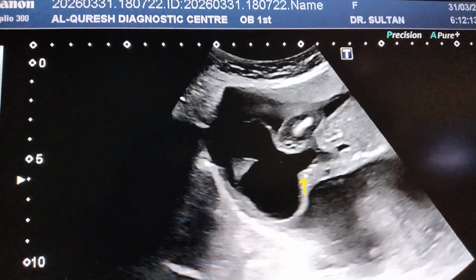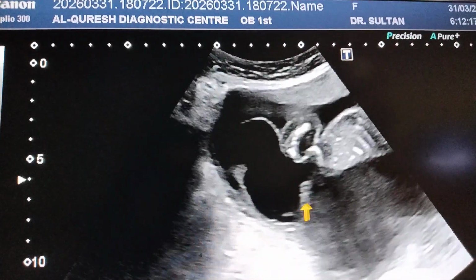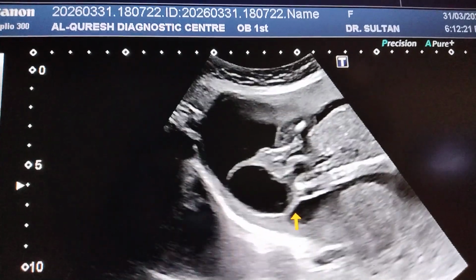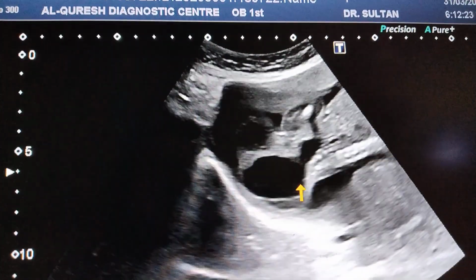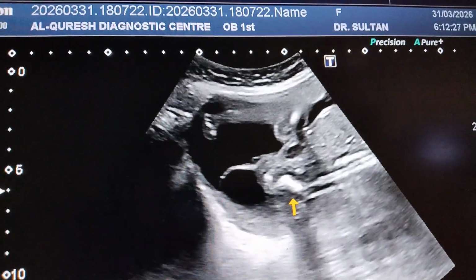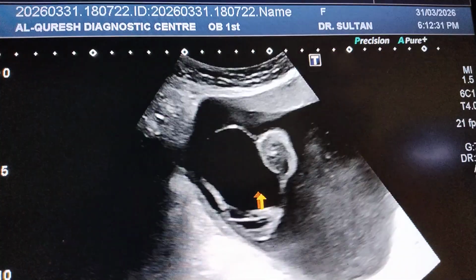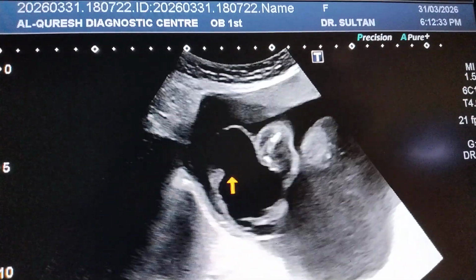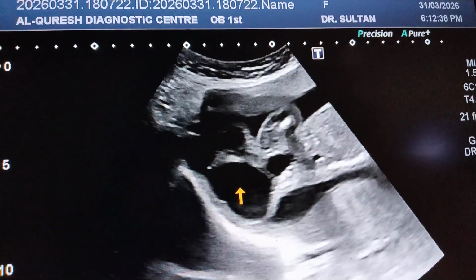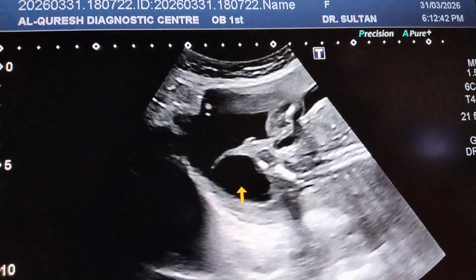So this lesion is arising from the sacrum and coccyx. So both the segments are involved. This lesion, which is arising from the sacrum and coccyx of the fetus, is pure cystic, we can't appreciate a solid component. This is most likely a sacrococcygeal teratoma.